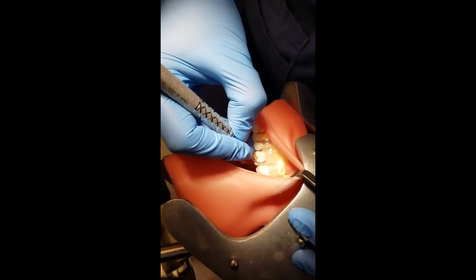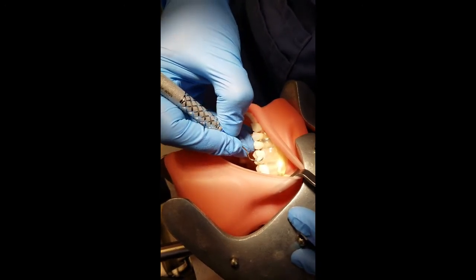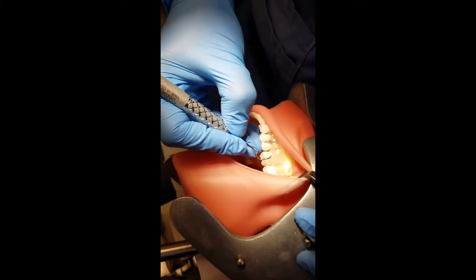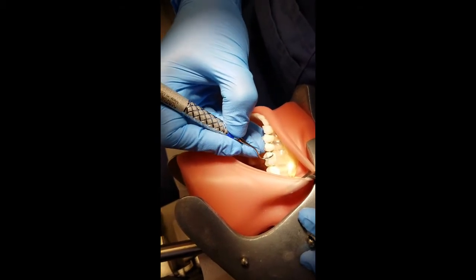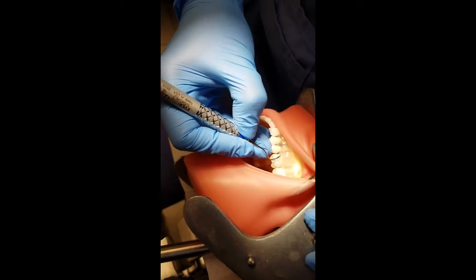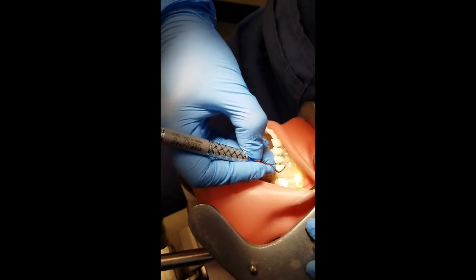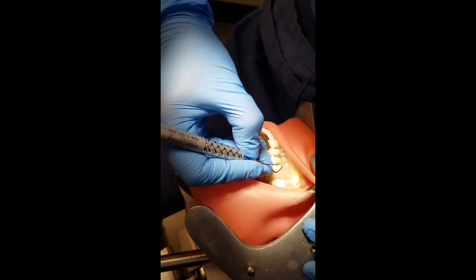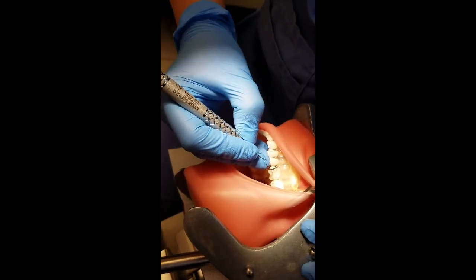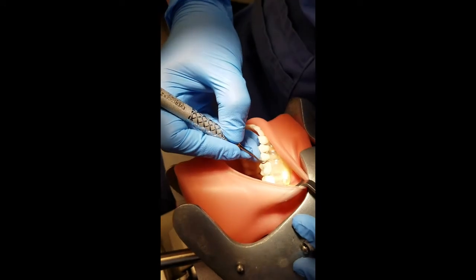Continue to work across the facial or lingual surface, adapting the tip at the height of each stroke by rolling the handle. Once at the mesial line angle, you want to explore at a closed angle, so a big distal rock is used to explore, making the terminal shank less than 45 degrees on the tooth. Then you're going to scale at 70 to 80 degrees using a little mesial rock, making sure the terminal shank does not go past parallel.